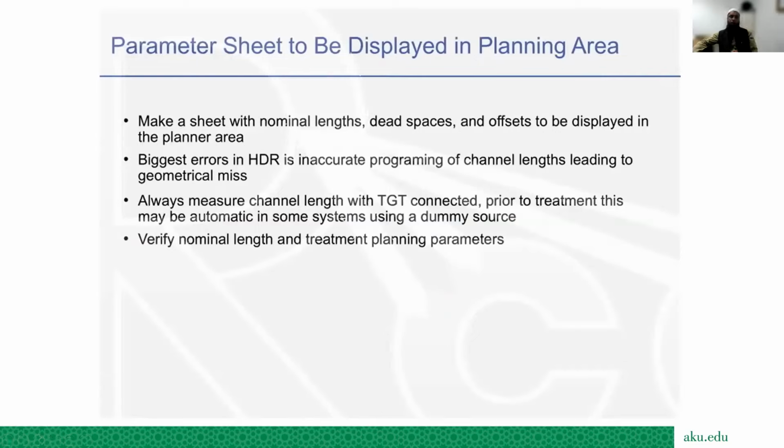lengths, which can lead to the geometrical miss. So these distances are very important, and everyone should use these distances while doing the planning.